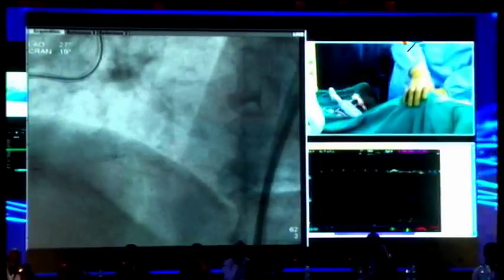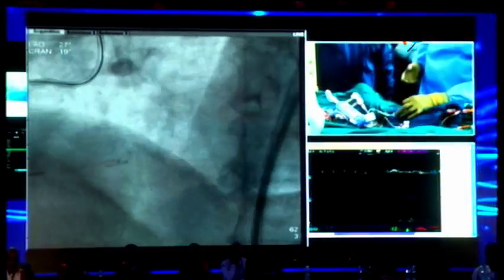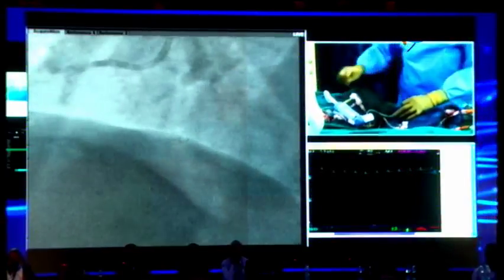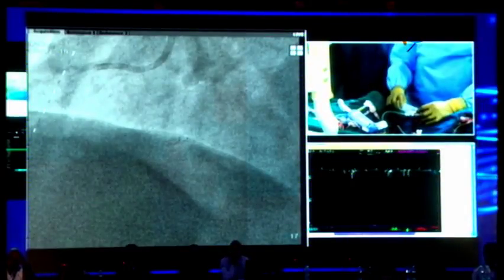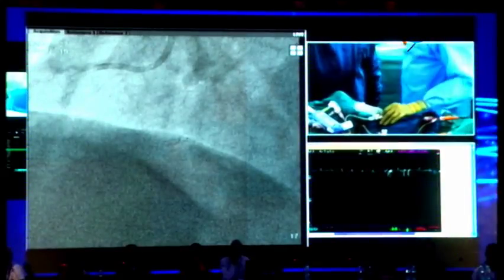Good view, bad view, right? Okay. Very good view. Now we can see. Bad view. No, he has to. Bad view. Now we have to change it. Okay. He's seeing the balloon like this. I don't want to see the balloon like this. I don't want to see that. Murphy's Law, right? Now he told about the view because we can see it. Okay, got it. So can I have an artery forceps or something?